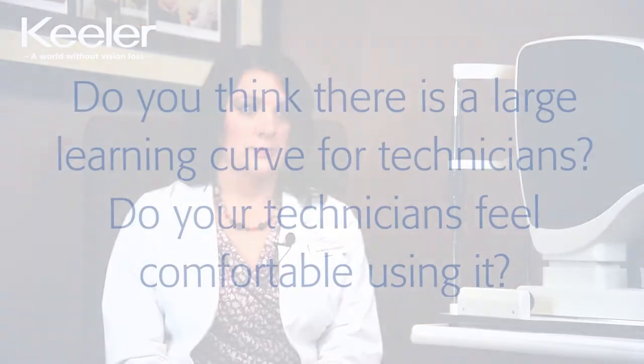a lot of these treatments have a slow impact on their symptoms. It may not be an overnight change. They are very quick to judge it and go back and say, well, that expensive treatment didn't work. So we can go back and say, well, here was your tear film before, according to the HD Analyzer, here is it after. Look at this tremendous increase that you've had. And you can't argue with something that objective, obviously.